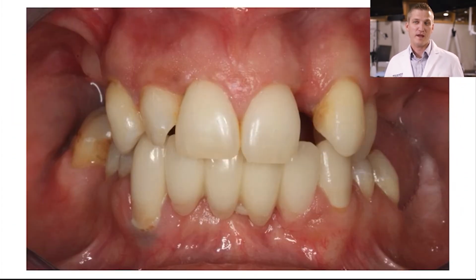All right, welcome to our live surgery now. This is going to be our introduction to our patient. We're going to be doing sinus surgery and posterior implants. So let's go ahead and take a look at some of these slides. Here we have a 30-year-old female, good health patient, happens to be missing posterior teeth, one anterior tooth. We're excited to plan implants for her in the upper left in this video series.